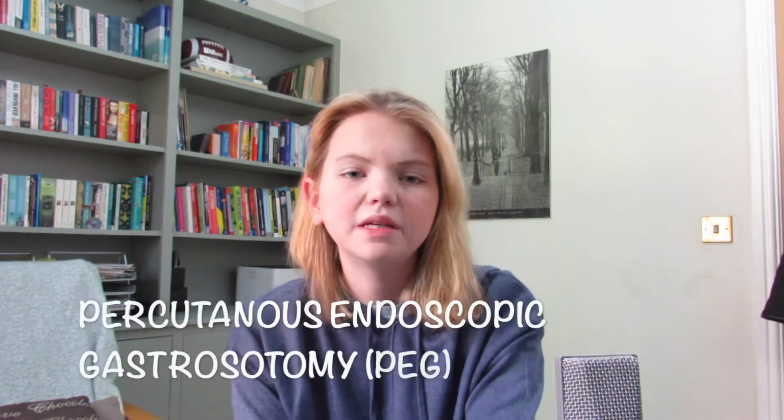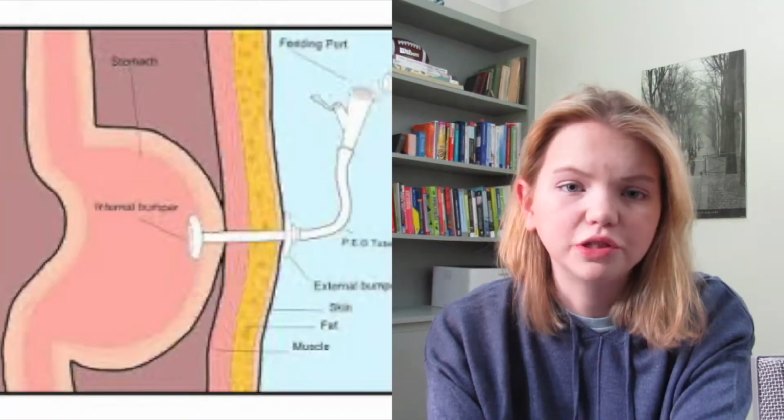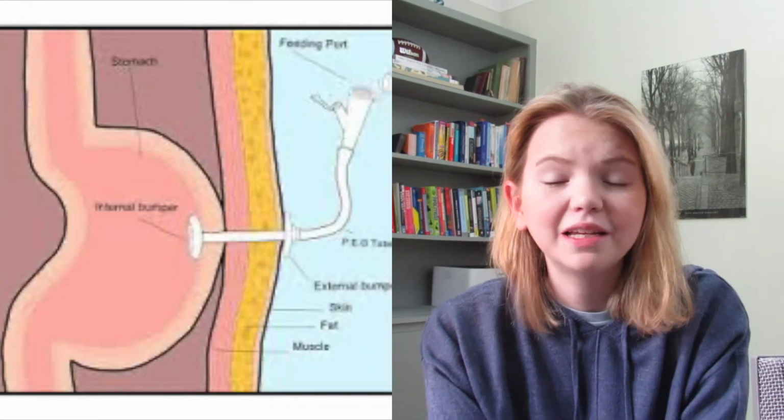The next major type is a PEG. It's also known as a G tube. Either stands for a gastrostomy tube or a percutaneous endoscopic gastrostomy tube. They're both very similar. One's placed by endoscopy and one's placed surgically. This tube goes directly through the stomach wall, the same as an NG, but just goes directly into the stomach instead of through the nose. The advantage of having it not through the nose and directly through the stomach wall is obviously you don't have something on your face all the time. It's a bit more comfortable, but also there's a disadvantage in terms of there's a higher infection risk.